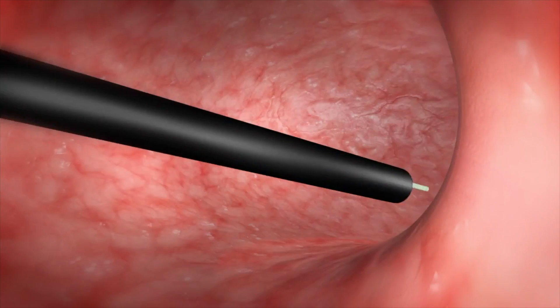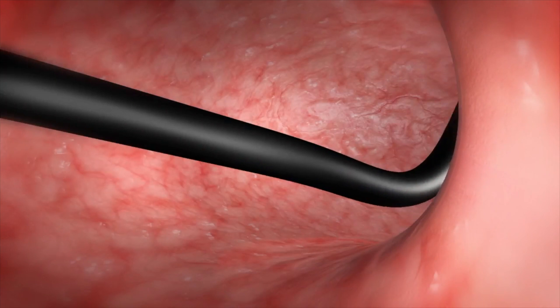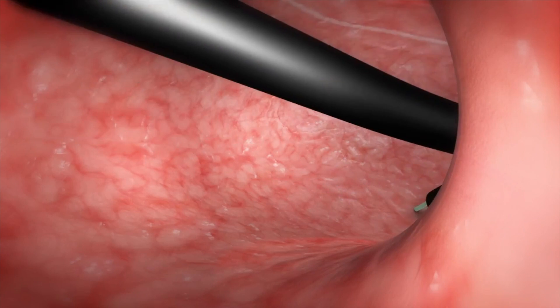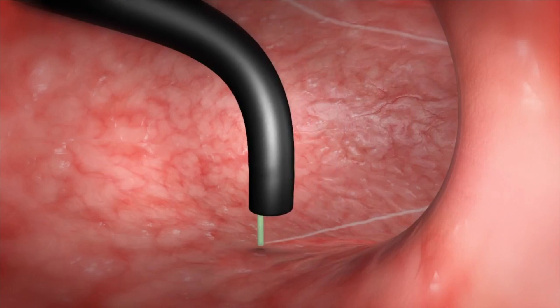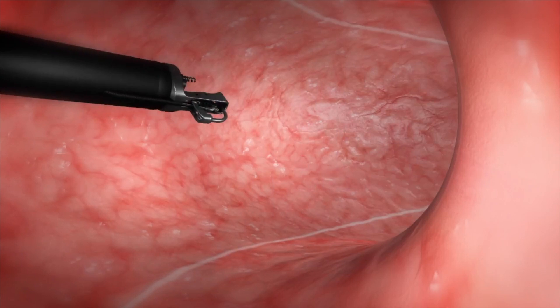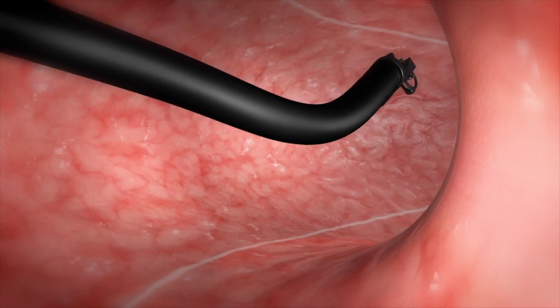We start initially by marking the areas that we want to suture — the anterior wall and then the posterior wall of the stomach. Then we use a suturing device that is loaded on the tip of the scope to place full thickness sutures in the wall of the stomach.